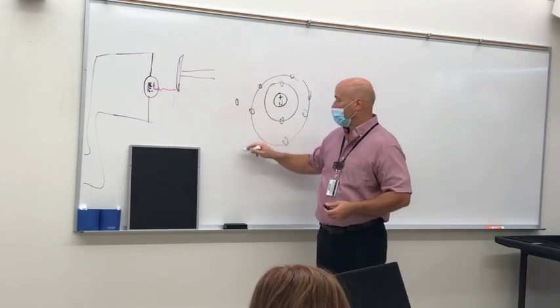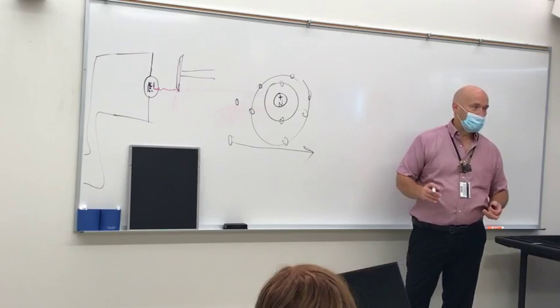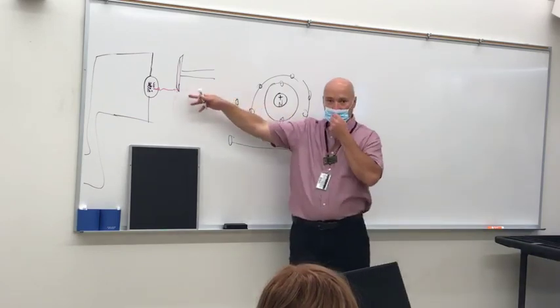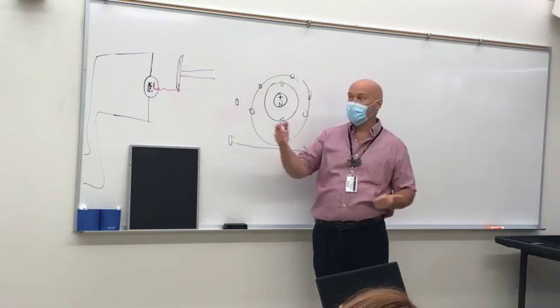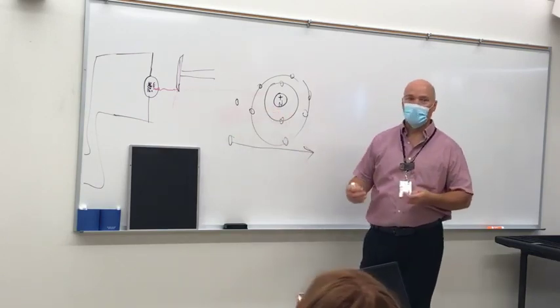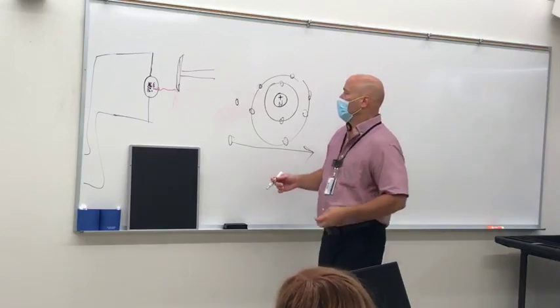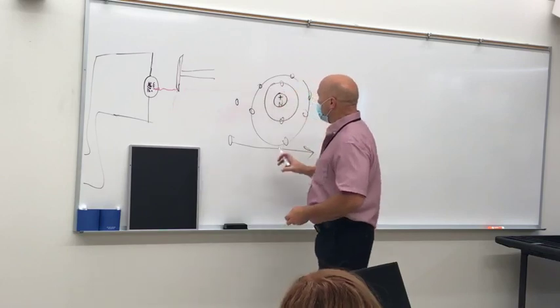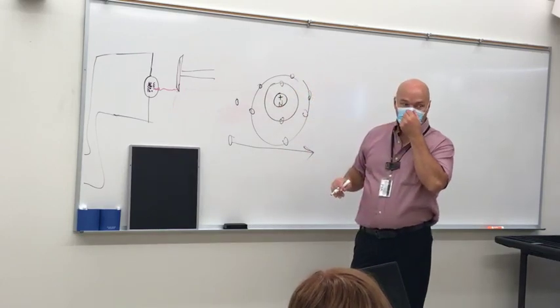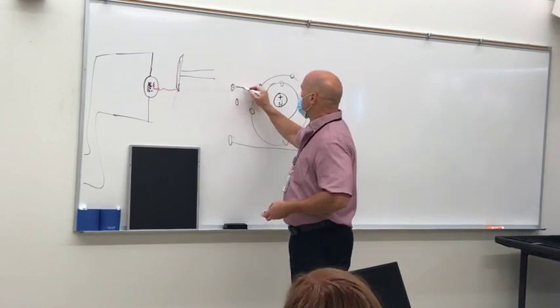Most of them, in all honesty, are going to bypass that and do nothing except add heat to this. That's all they're going to do, because the main thing we create is heat. So the main thing that we're dealing with here is heat. Most of them aren't going to do anything. Most of the ones that are going to do something are going to pass so far away from the nucleus of the atom they don't do much. But a few of them are going to get close to the nucleus of the atom.